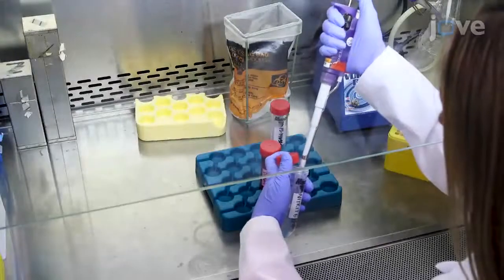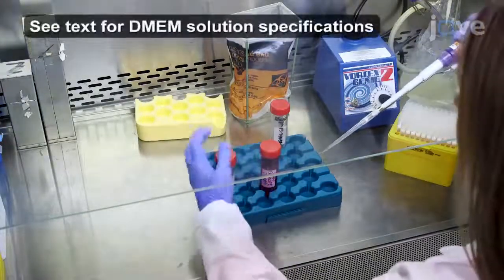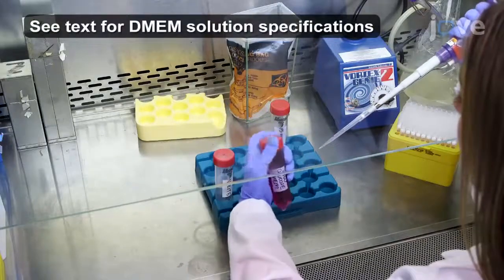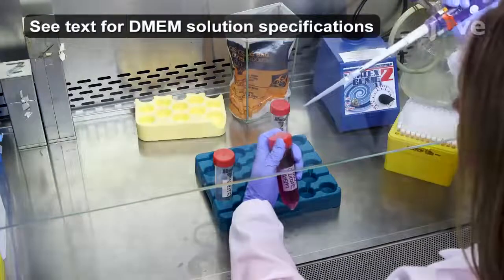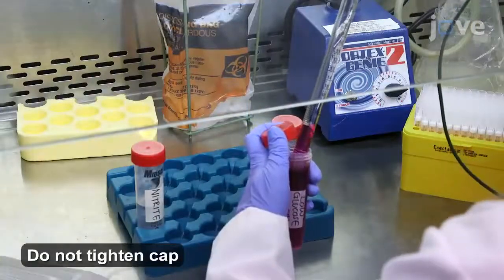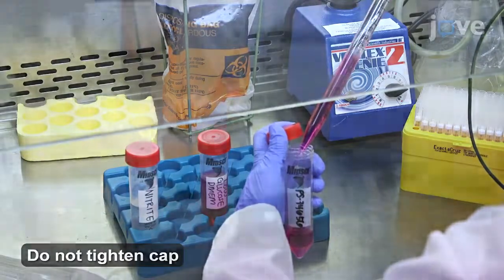To begin, add 0.5 milliliters of nitrite stock solution to low glucose DMEM containing L-glutamine, sodium pyruvate, and fetal bovine serum. Then place 20 milliliters of the medium in a sterile 50 milliliter conical centrifuge tube.